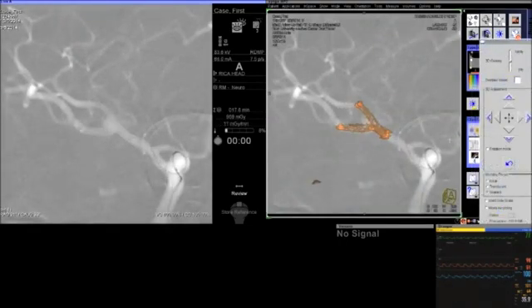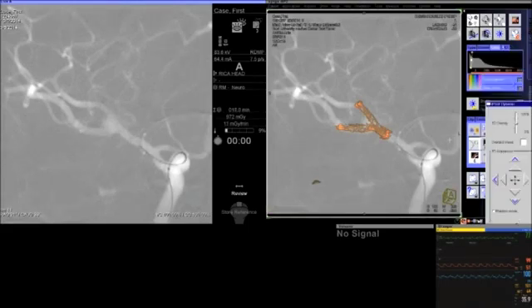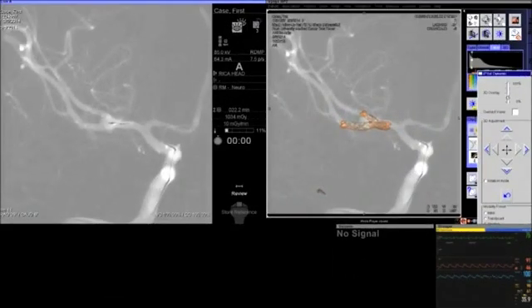One can argue that it would be okay also to place the microcatheter in parallel, but I think it's quite busy when you have to construct a Y and have a microcatheter into the aneurysm position, especially on small aneurysms like this one. So I think that this overlay technique allows you to have a nice idea of where the transition between the parent vessel that you have created with the Y construct and the aneurysm is.